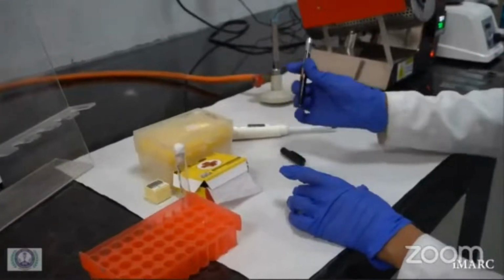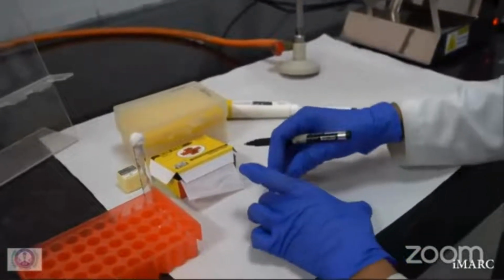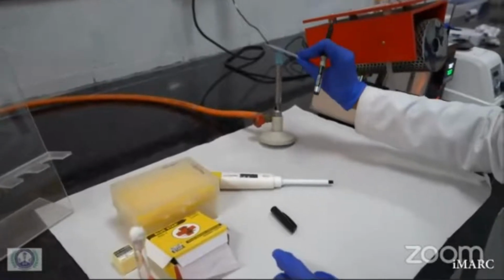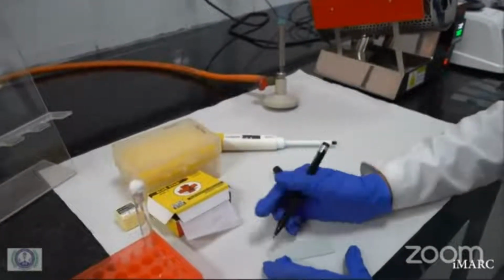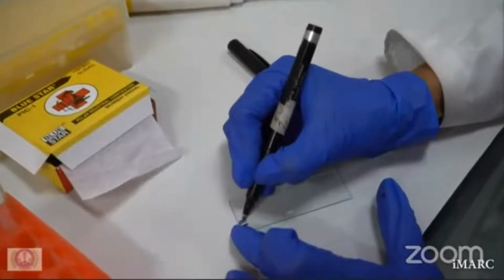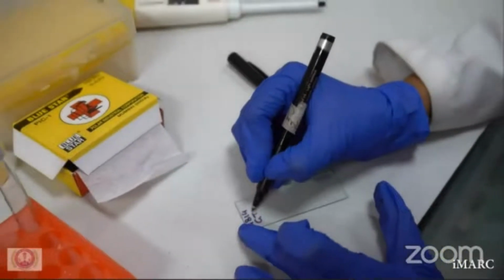Once the capsulated yeast are ruled out and the isolate is confirmed to be pure, the next step in identification in yeast is the germ tube test. The germ tube test is used for presumptive identification of Candida albicans and is a rapid screening test. But this test must be validated with cornmeal agar.